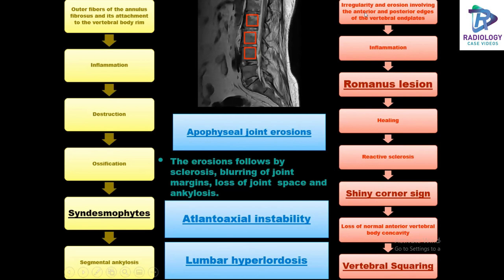There are irregularities and erosions involving the anterior and posterior edges of the vertebral end plates, resulting in inflammation appearing as Romanus lesions on MRI. The healing process and reactive sclerosis appears as the shiny corner sign, and loss of the normal anterior vertebral body concavity results in vertebral squaring.